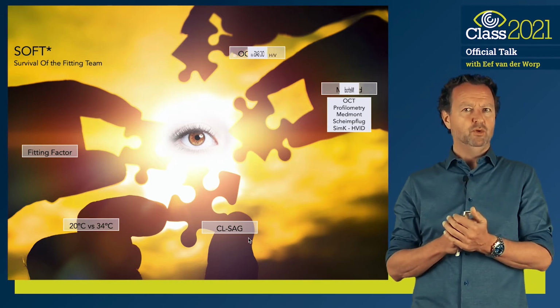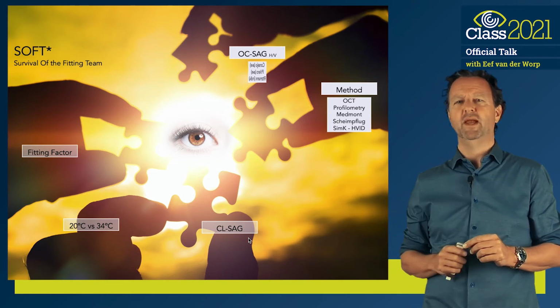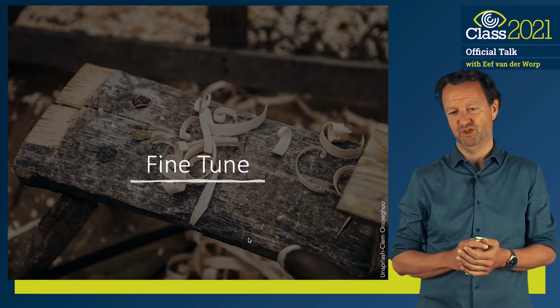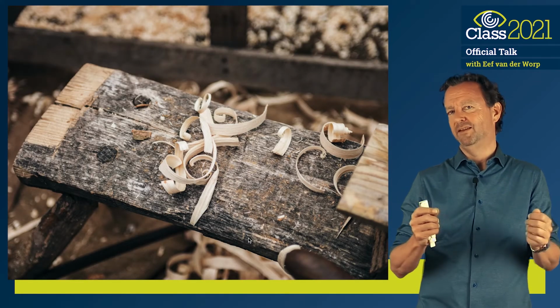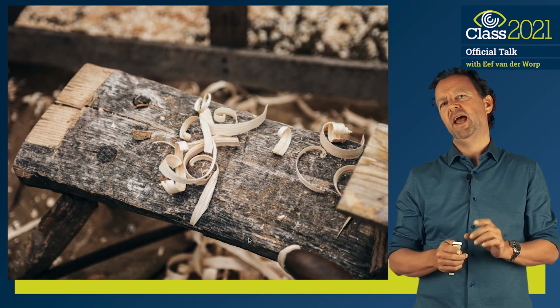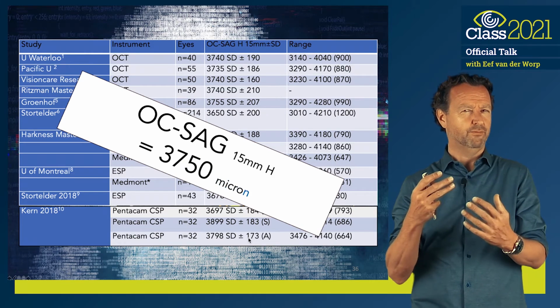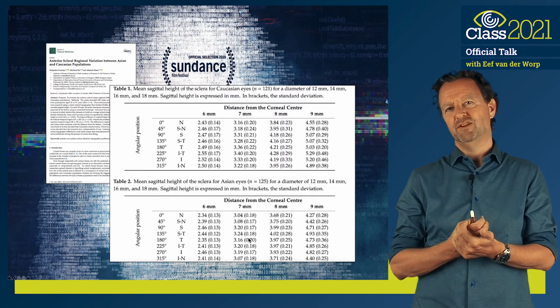So we know a thing or two actually about that ocular surface. But wait, there's one thing we actually have to look at. It may be just a little bit more complex than just that. Let's fine-tune that a little bit. We may have to plane the wood a little bit, because as I said, in different meridians, different sag heights may be applicable. We're looking at the average in the horizontal meridian, but what about the vertical or the oblique? Are there differences? Well, the thing is, nobody has really looked at it.